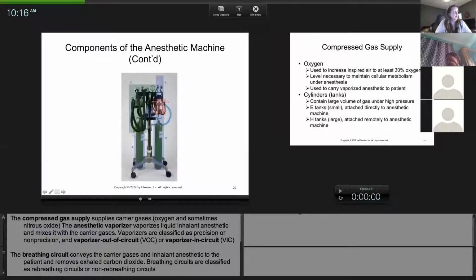If you look here, at the top, there are two glass domes over letter C. Those are the unidirectional valves. And the two black tubing, one is the inhalation hose and one is the exhalation hose. But these valves at the top keep it going in one direction. And again, remember the video I sent you, he goes through a machine and explains all this. So it's a really good video.